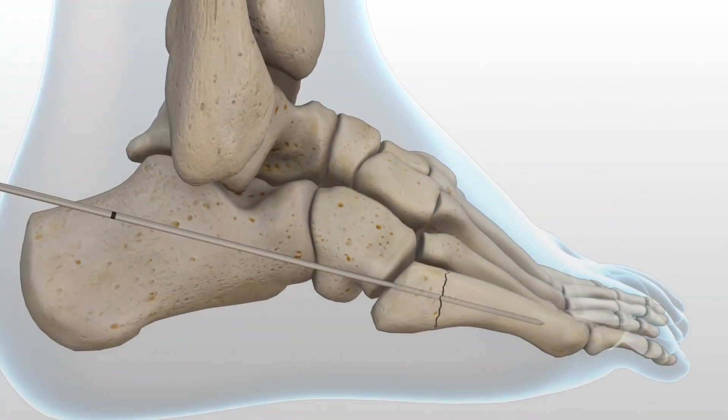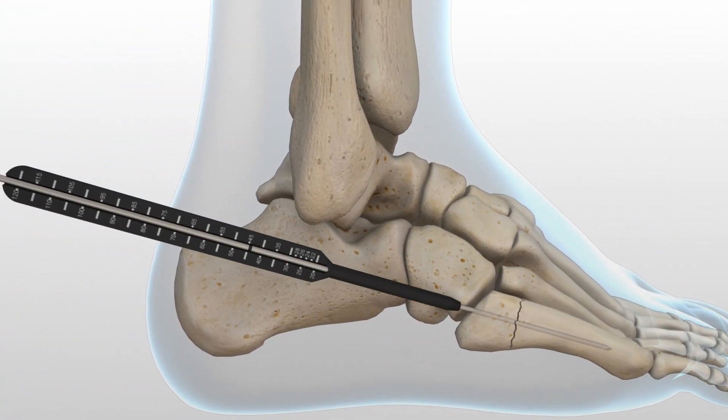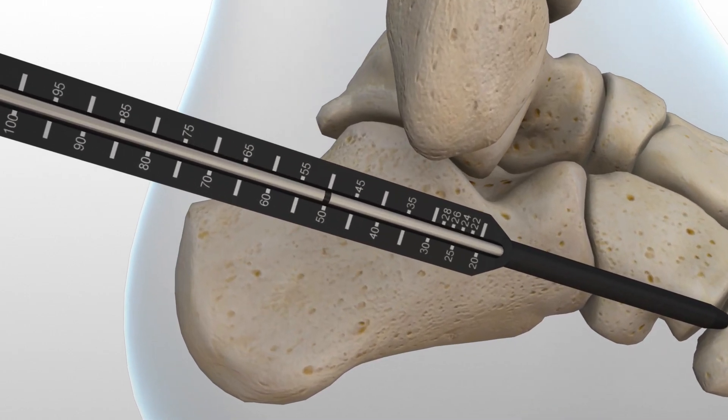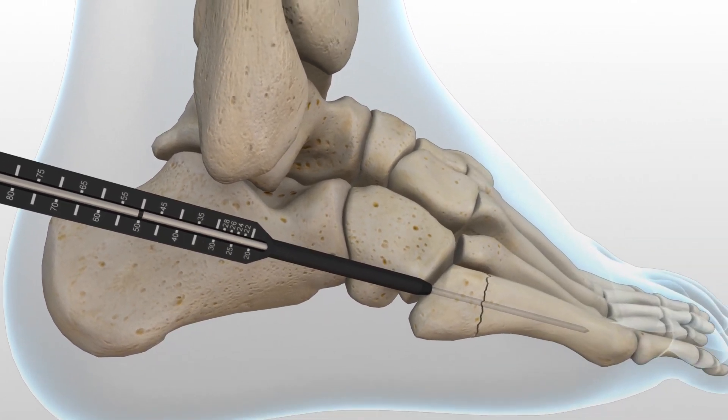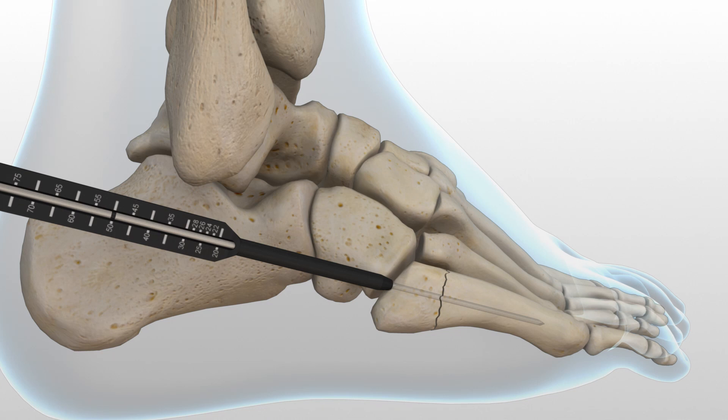Using the cannulated depth gauge, depth is measured from the exposed portion of the guide wire by reading the line on the scale. In order to account for countersinking and fracture compression, a screw that measures four to five millimeters shorter than the measured total depth is selected.